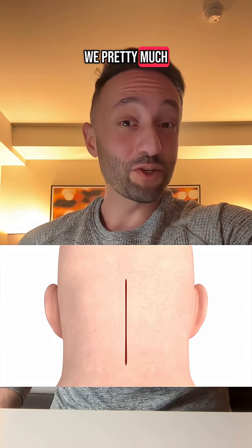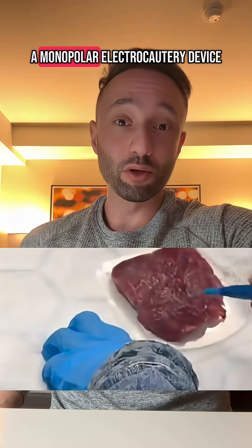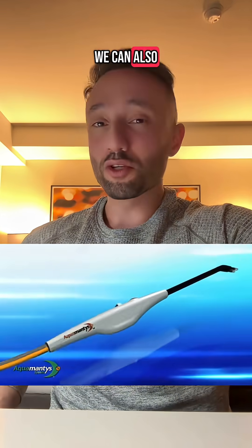The short answer to that question is we pretty much burn the blood vessels. After we make our incision, we have this device called a bovi, otherwise known as a monopolar electrocautery device. It's designed to use electricity to actually cauterize the blood vessels that are bleeding. We can also use a device called a bipolar electrocautery device.